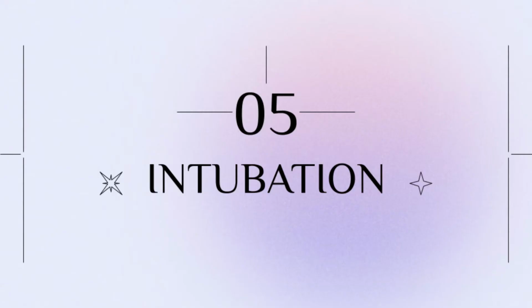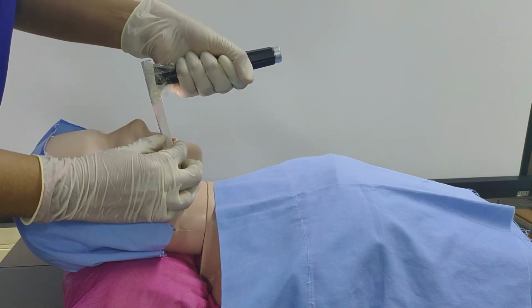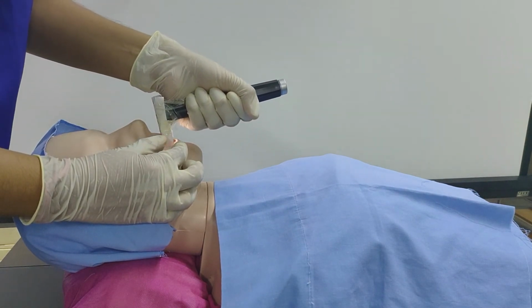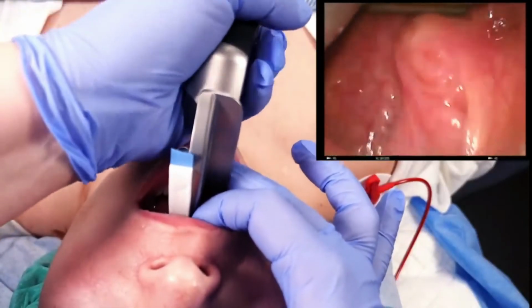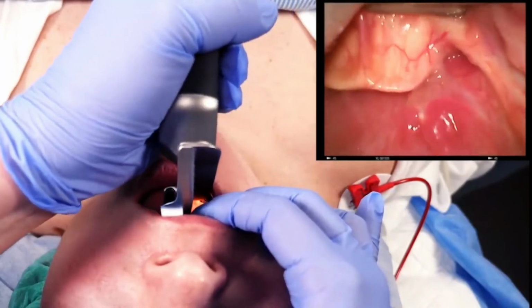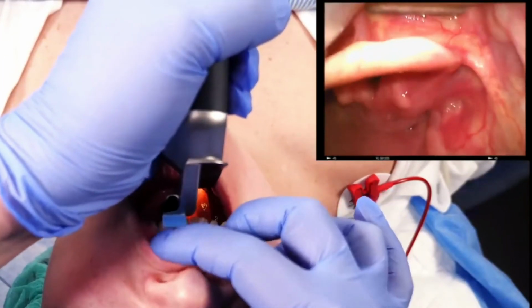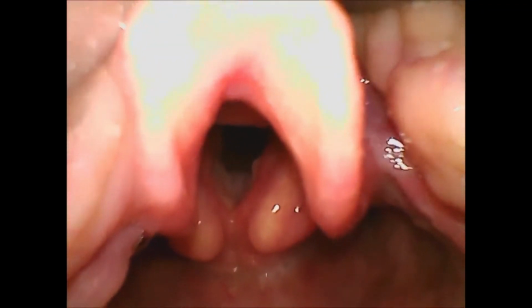Step 5. Intubation. Hold the laryngoscope with your left hand and insert the blade in an anterior-inferior direction along the right corner of the mouth and sweep the tongue to the left. Advance the tip of the laryngoscopic blade till the glottic opening is visualized. Wrist motion must be avoided and the maxillary teeth should not be used as the leverage to avoid damage.